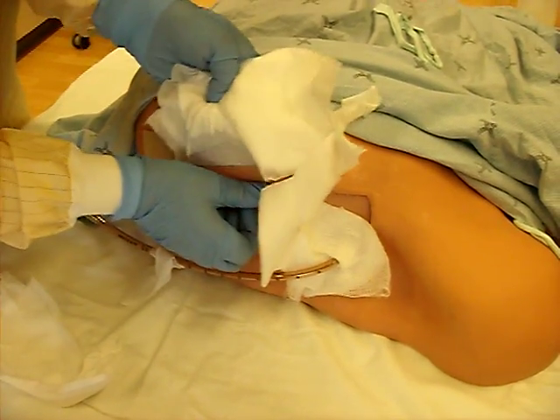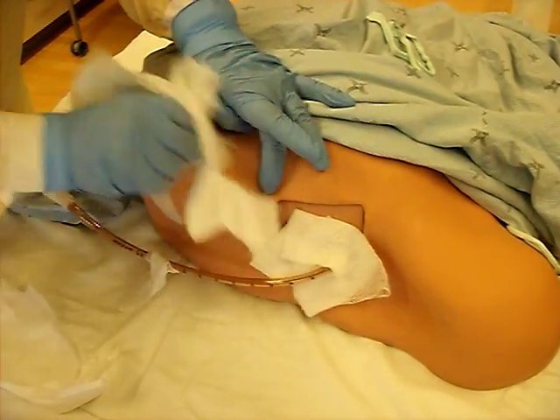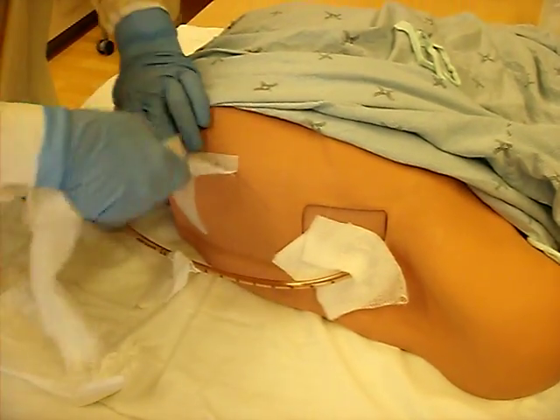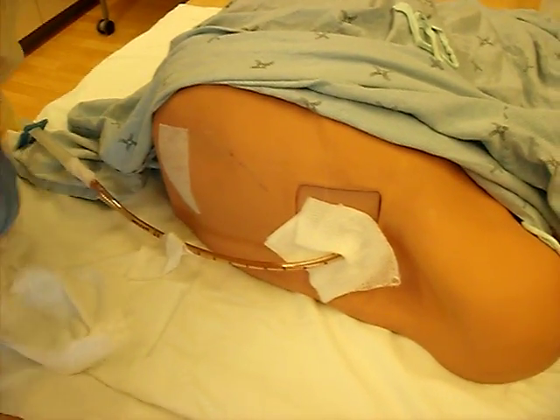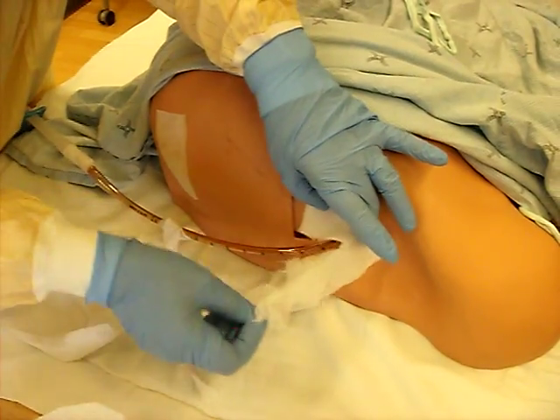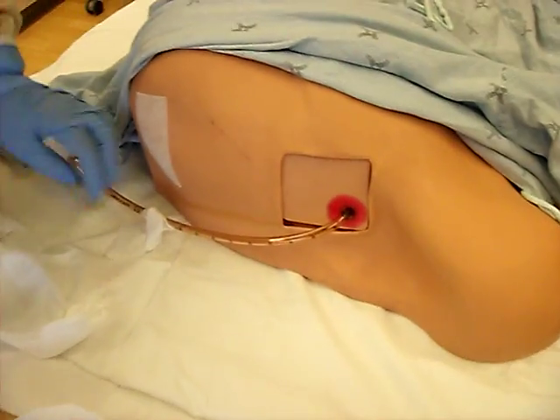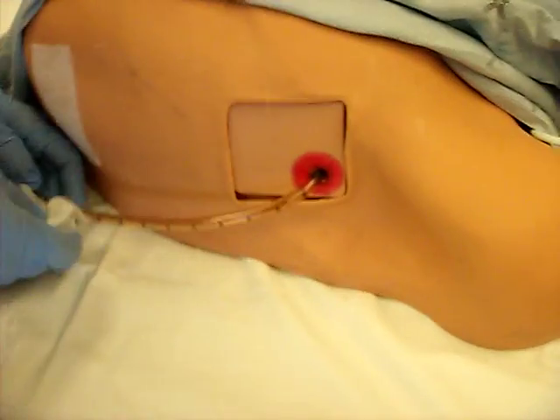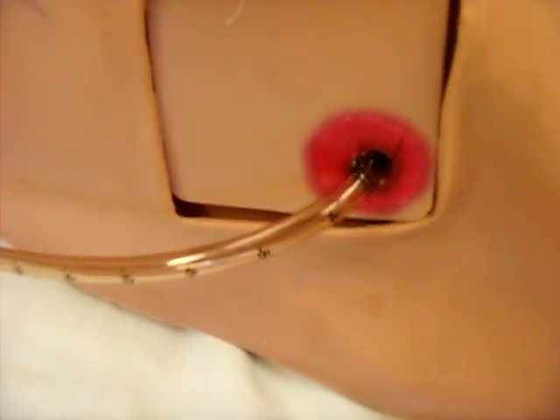Remembering that this tape sticks much better to a model than an actual human. So you're going to pull down all of this dressing, removing it from the patient. And again, it's not going to be as sticky as this. And we'll cut to the chase here. There'll be gauze, usually either with a slit in it, almost like a trach sponge. But once you take it down, you'll notice that the chest tube enters the patient's body and has a suture, which is tied in and looped around the chest tube.